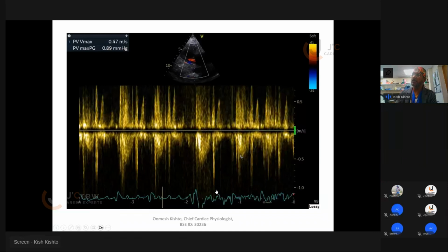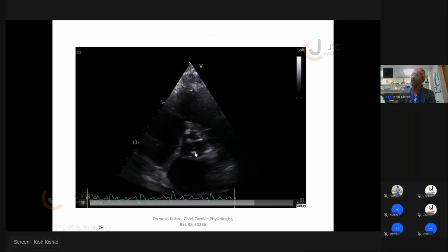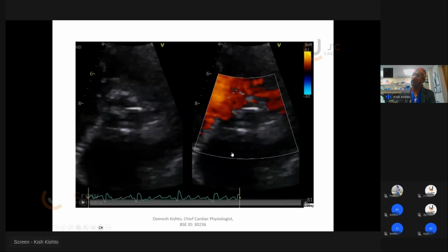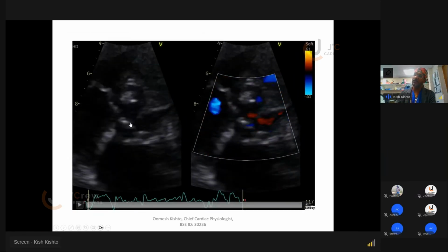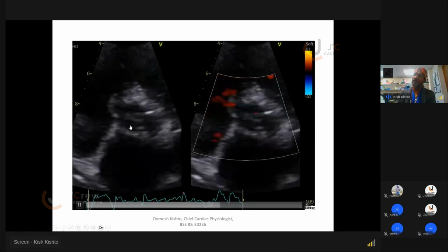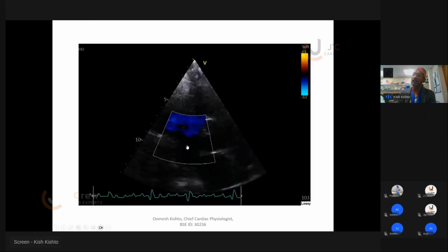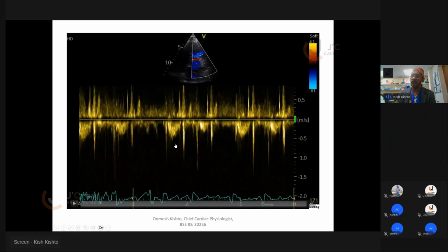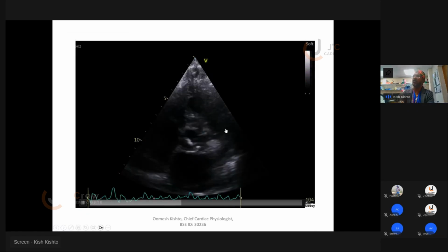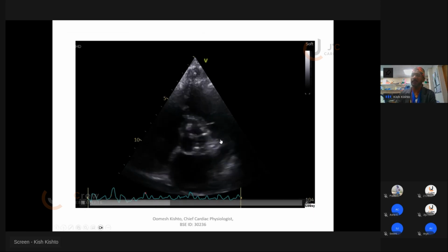And also, let's look at the short axis view. From the short axis view, the non-coronary cusp, which we were thinking is a bit thickened and fluffy, it's very difficult to say whether there's something there or not. So I got myself covered by getting one of the doctors to double check it. The more you look at it, you can stare at it all day. Sometimes you won't see anything.